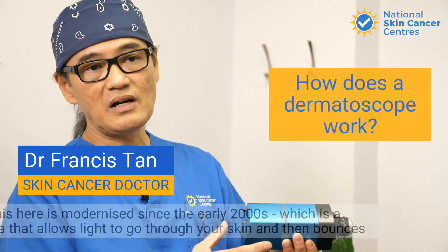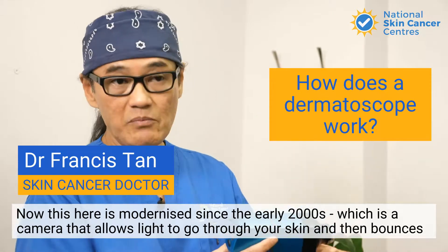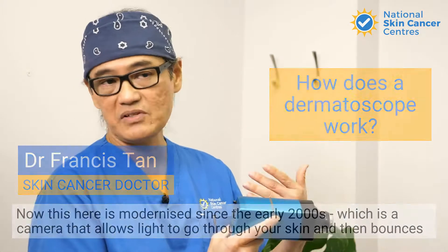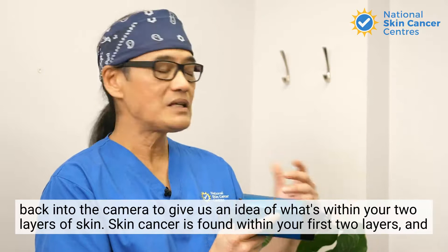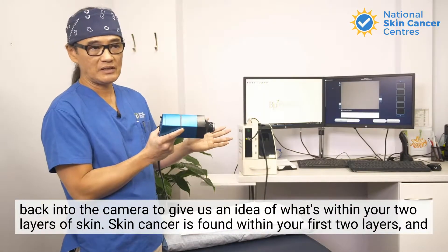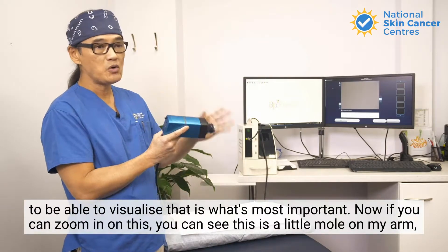This here has been modernized since the early 2000s. It's a camera that allows light to go through your skin and then bounces back into the camera to give us an idea of what's within your two layers of skin. Skin cancer is found within your first two layers, and being able to visualize that is what's most important.